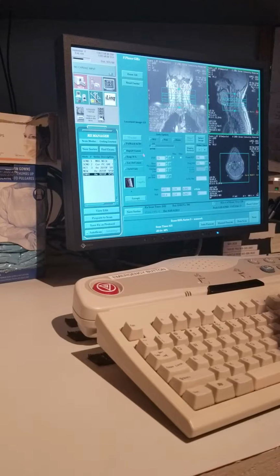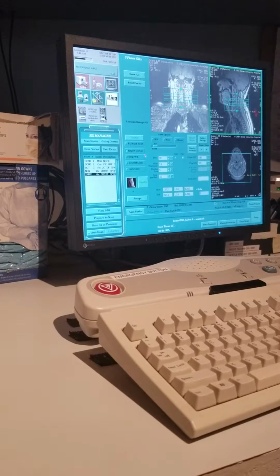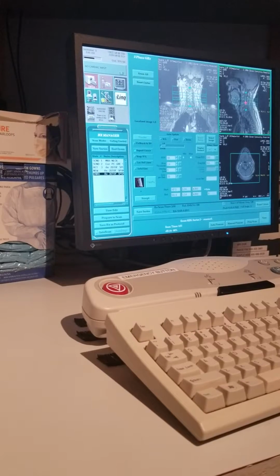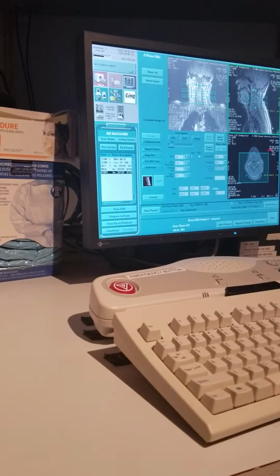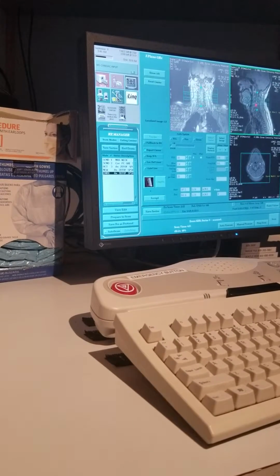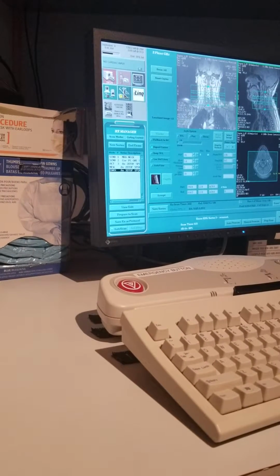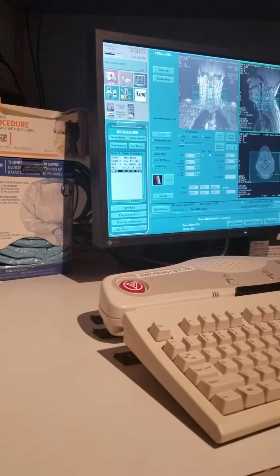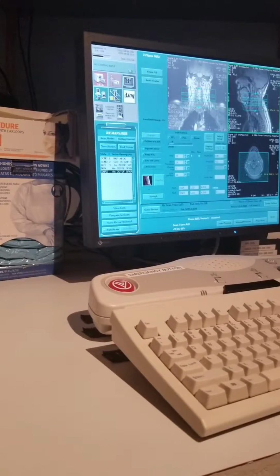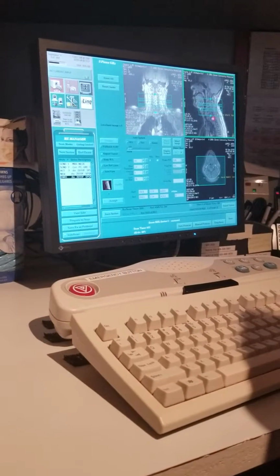Right now the report cursor is at 0. See that? If you bring it up to S5, which is barely anything. We're centering at S5, which we're pretty much there. Why is the cursor not moving? See? So you're at S11, S6, S5. You're talking about 5 millimeters, it's not a big deal. I just want you guys to understand that this is the kind of thing you have to do to find your exact position. So now we want to center this.